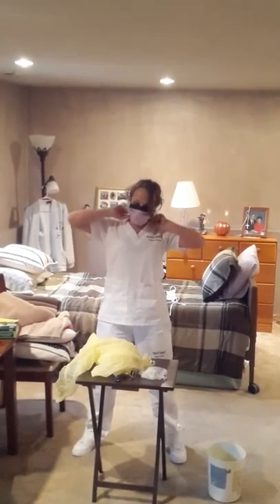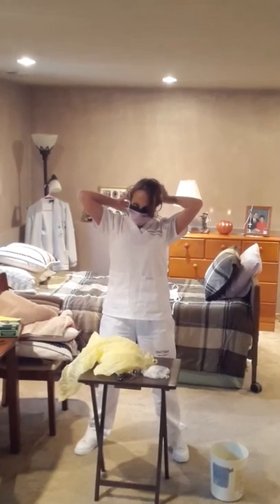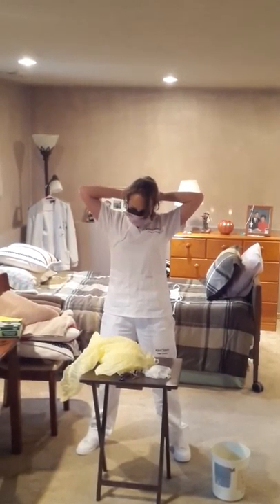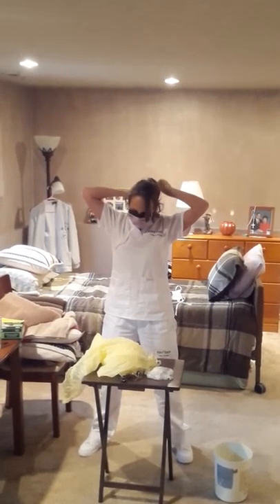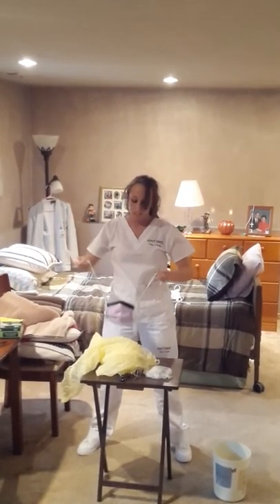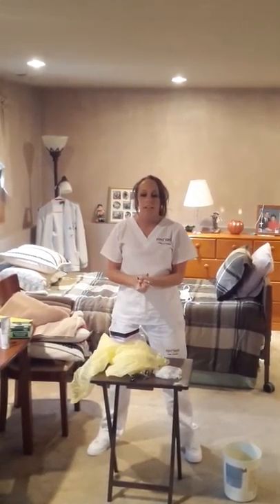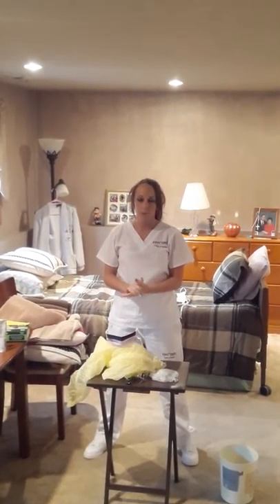Then I'll take off my mask. And last I'll take off my cap. Then I would wash my hands, and that is the PPE video.